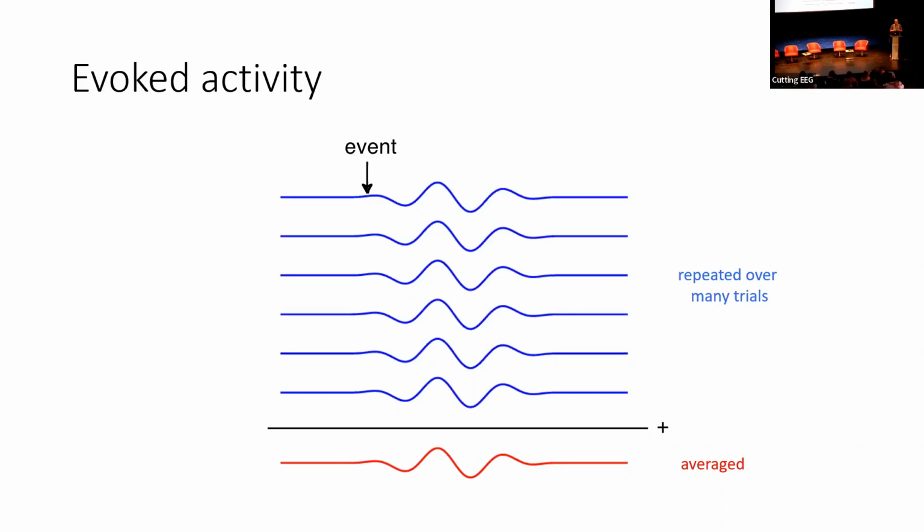I have a question about optimizing my effort in terms of the number of trials I have in an experiment and the number of participants. You've shown us how the signal to noise ratio improves with more trials, but you get diminishing returns because of that square root term. If I'm trying to estimate a population value using individual subjects, is it a truism to say that the same square root of n applies to participants, or does it show diminishing returns faster or slower, assuming you're testing undergraduates who are a pretty homogeneous group?